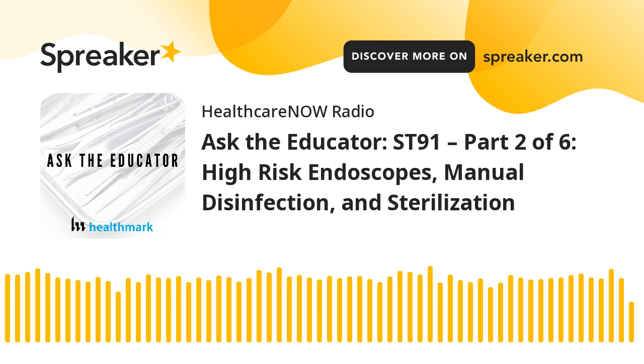Yeah, that's a great question, Kevin. Like I said, there are different types available for different settings, so look into what works best in your facility. The other option that we see a lot of is migration to central processing, moving those scopes from the off-site locations that are still affiliated with a healthcare system to sterile processing. Then you've got to think about logistics and turnaround time, and making sure you have adequate supply to send them either to central sterile within the hospital or to some offsite location where they'll be doing the reprocessing. But that's one way.